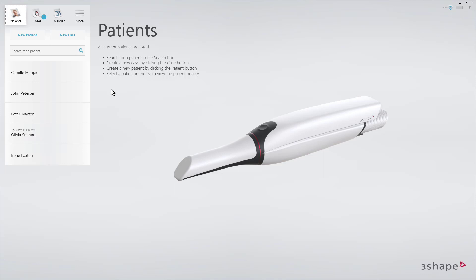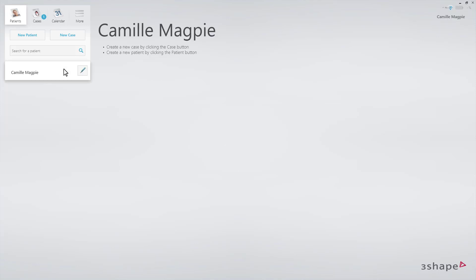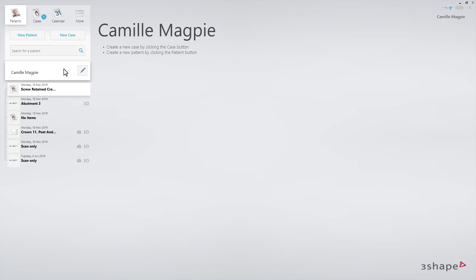Type in the name of the patient in the patient search field. If the patient already exists, the patient will appear in the list just below the search field. Select the patient.